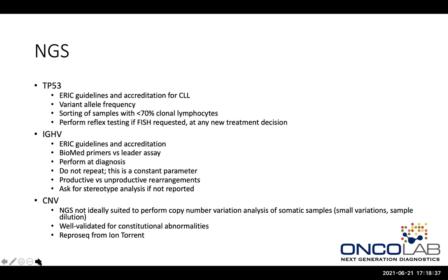We sort samples with less than 70% of clonal lymphocytes, and we perform reflex testing after agreement with our clinicians. If they want a CLL TP53 FISH, we will also do the sequencing. And obviously this is repeated at each new treatment interval.